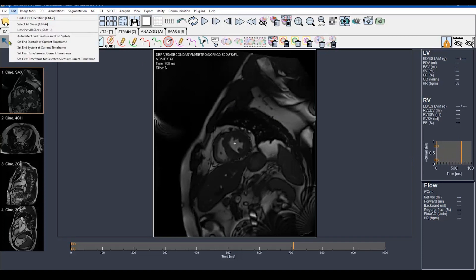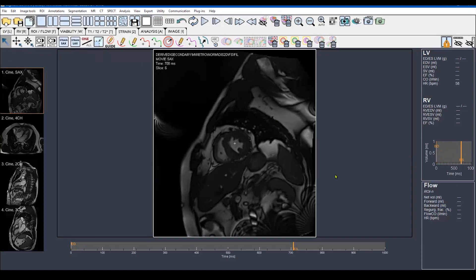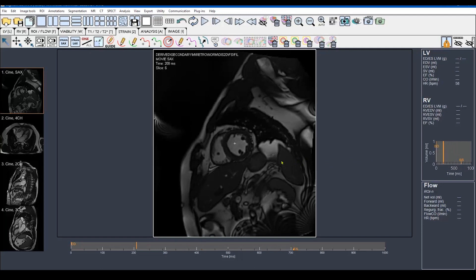From Edit, set end systole at current time frame. Now it's set to the correct time frame. Don't forget to scroll back to the initial time frame because the software must start the feature tracking from the initial time frame. Now I'm ready to move to the next step, which is Strain. In older versions you will find it under the MR tab, but in the new version it's located right here. Strain, and then Start Feature Tracking Short Axis.